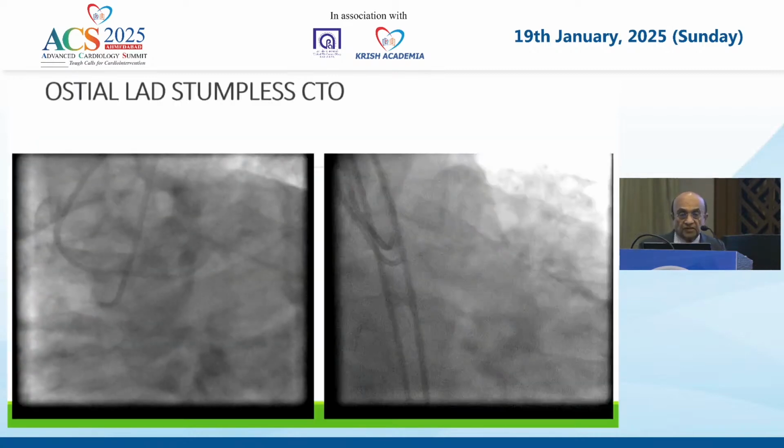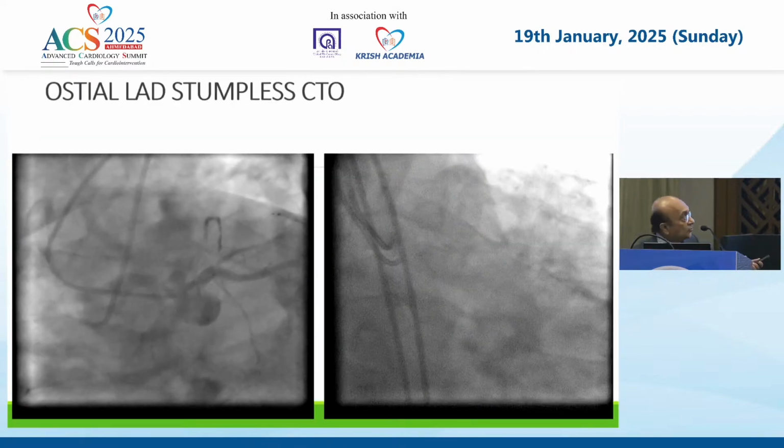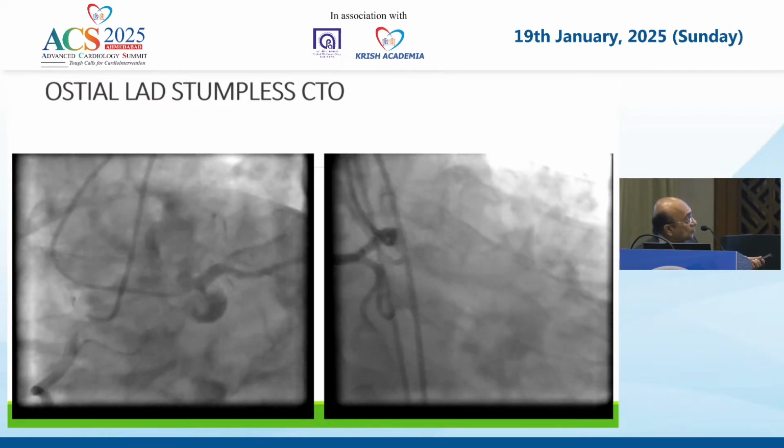So let me show you an example of the parallel wire technique. This is a stumpless CTO of the LAD. I can't see anything. So there are 2 ways to approach this.